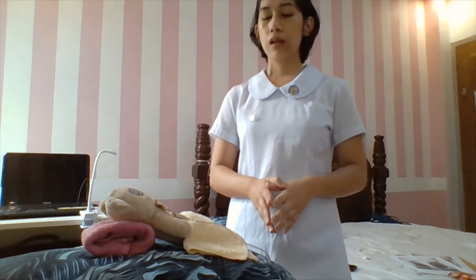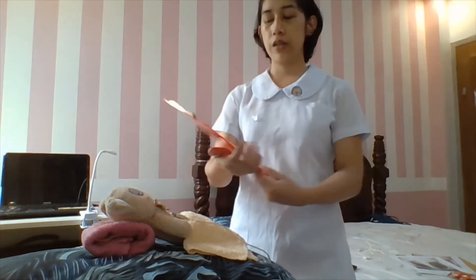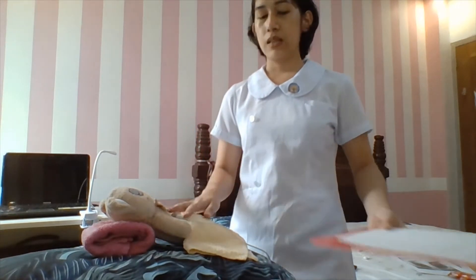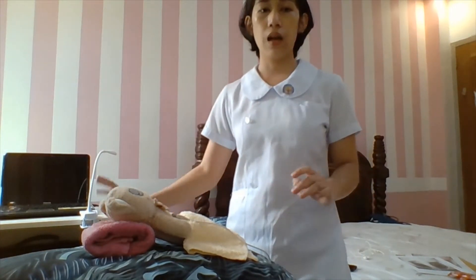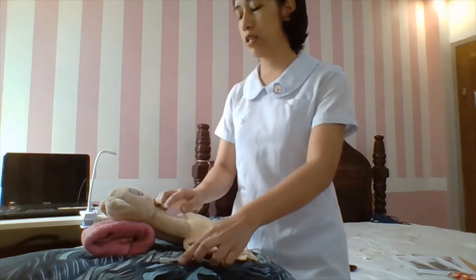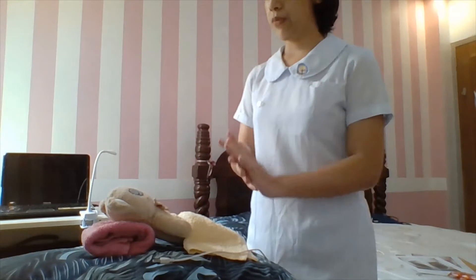We need to review the patient's medical record for the ECG order, assess the cardiac status of the patient, keep the patient away from electronic conductors, and inspect the patient's chest for skin irritation and skin breakdown.